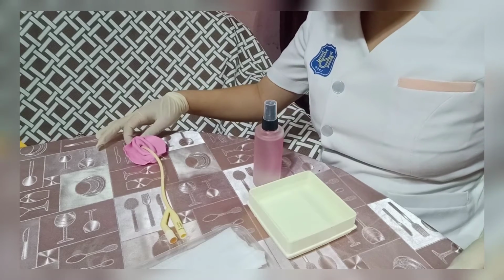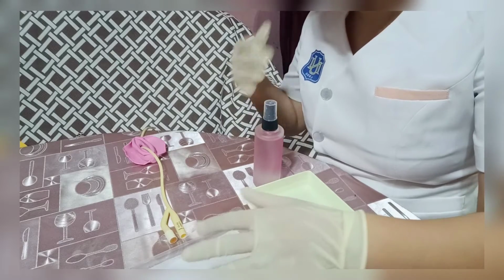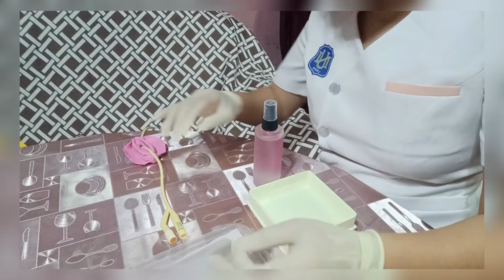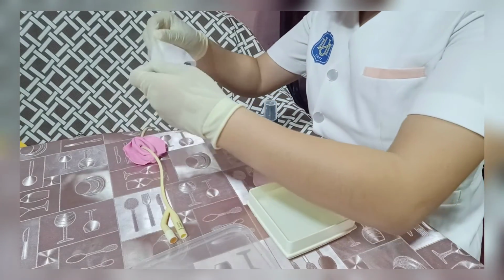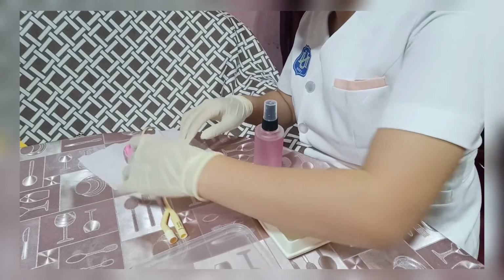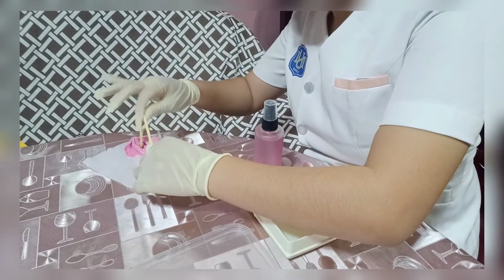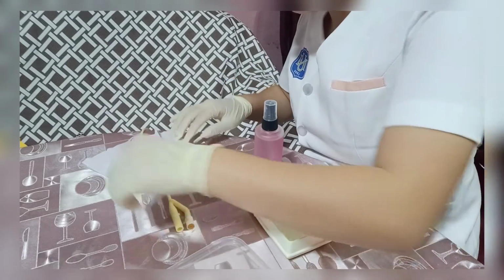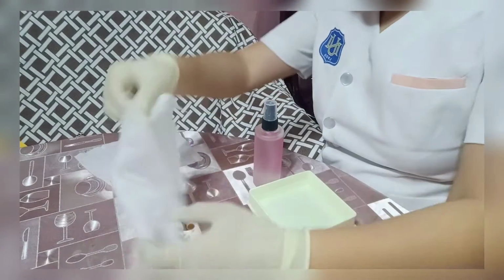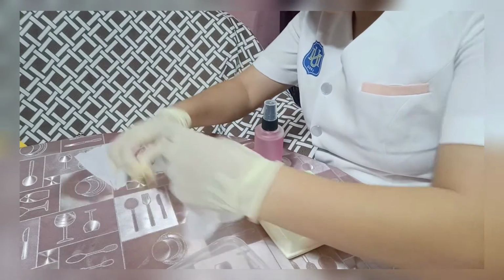After that, we have to expose the area where we could start the procedure. Provide a drape pad.